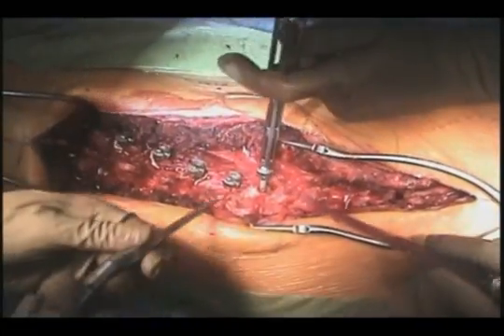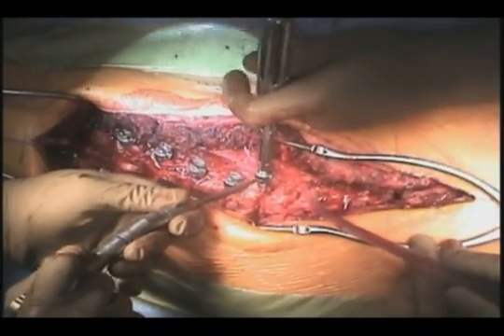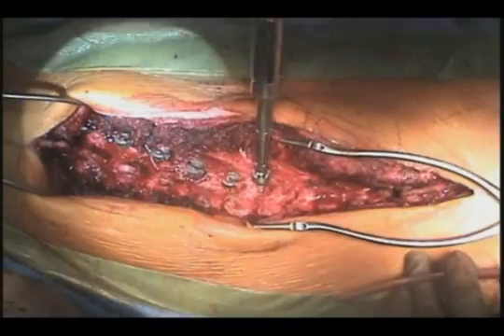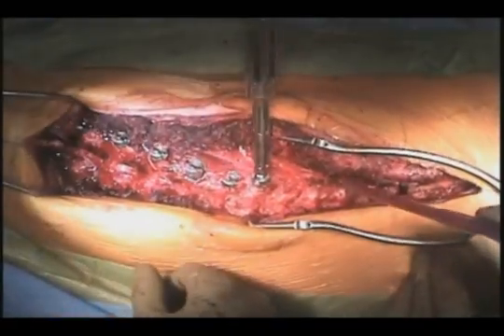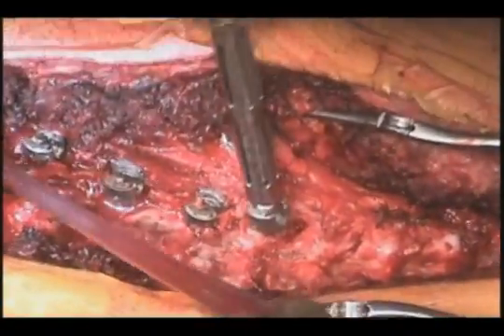Again, with the placement of the screw, there's a torque that is transmitted to the spine, and that shows how strong the fixation is and how really powerful these screws are in allowing us to correct the spine, as opposed to hooks that were used in the earlier generations of segmental constructs.